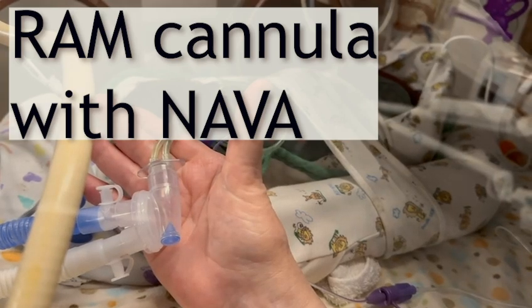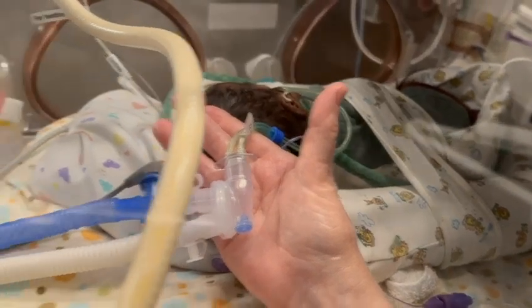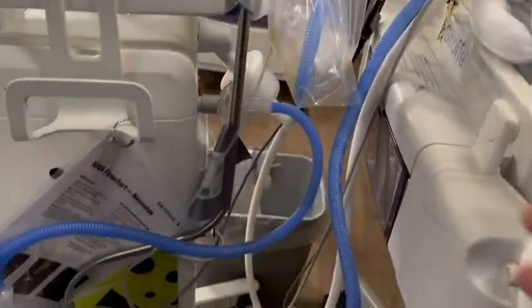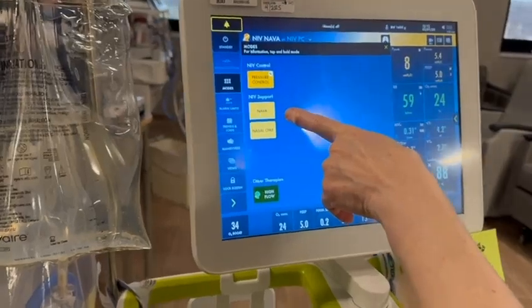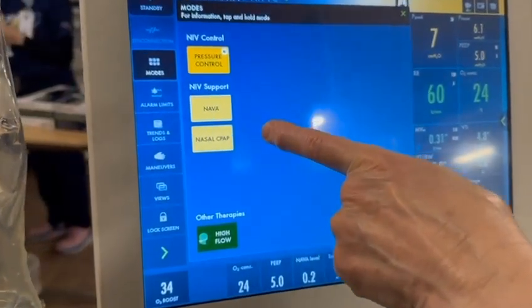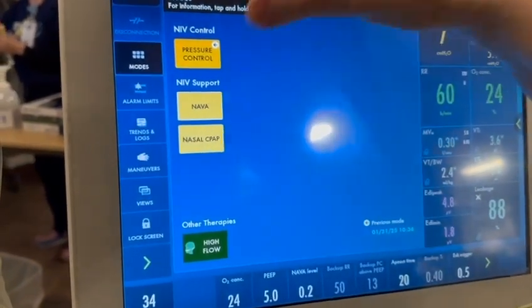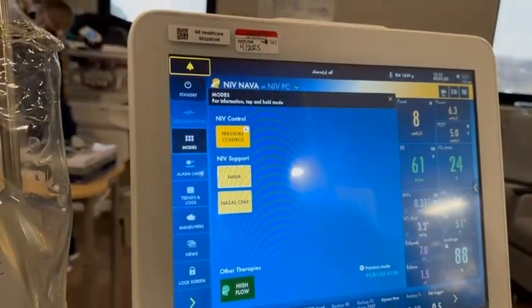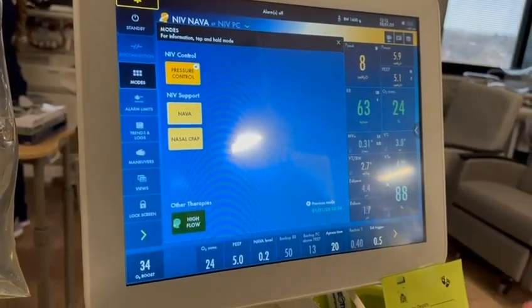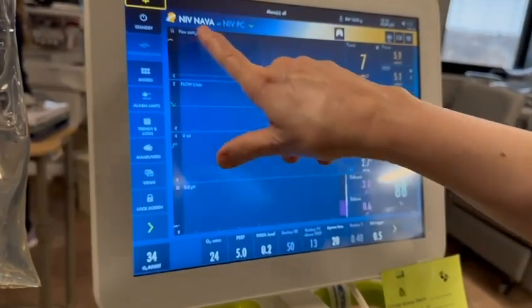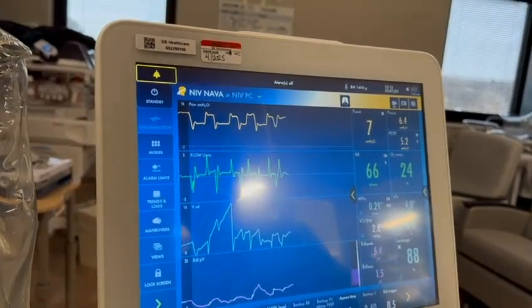This is the RAM cannula end connected to ventilator tubing. NAVA is simply one of the modes on the servo ventilator. NAVA uses the patient's innervation of the phrenic nerve as the trigger, versus flow or pressure like other vent modes. This is non-invasive NAVA because it uses the RAM cannula rather than an ET tube.